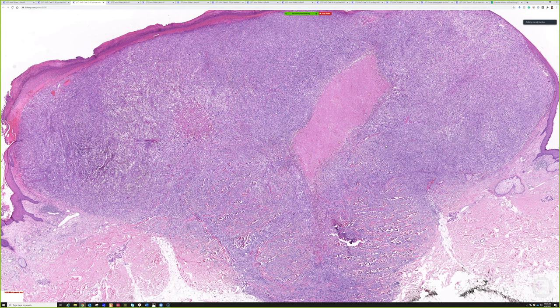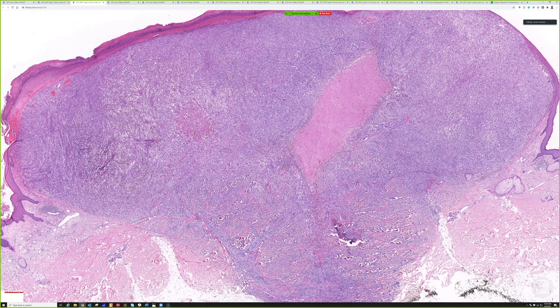When thinking of atypical fibrosanthoma, the more aggressive upgraded form is called pleomorphic dermal sarcoma — the term used when AFX involves the subcutis, is larger than about two centimeters, or shows necrosis, vascular invasion, or perineural invasion. Those features make us say this is probably not an indolent AFX but a more aggressive pleomorphic dermal sarcoma. I lump them together because they look the same; we just assign a different name based on higher-risk features.